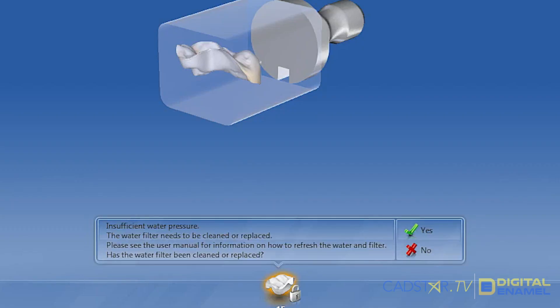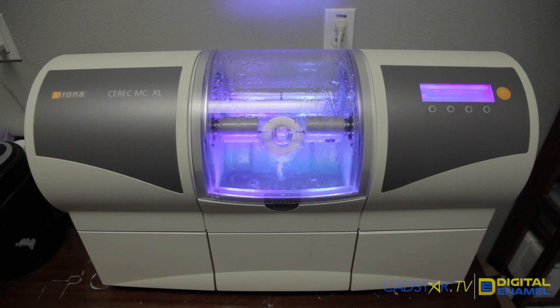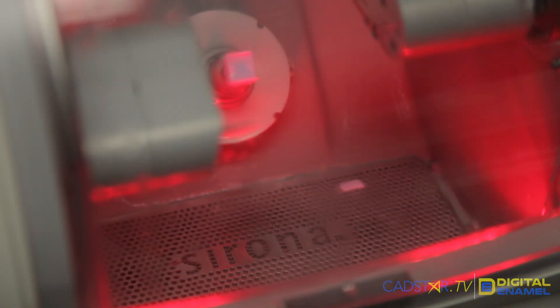So when you get that water pressure error — bright red light — how do you get through that as fast as possible? Because you want to make sure that you're milling, otherwise you're pulling your hair out and going crazy.